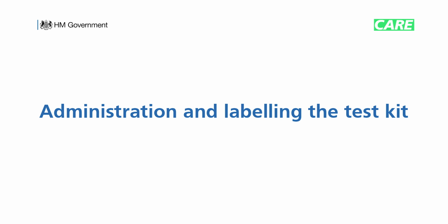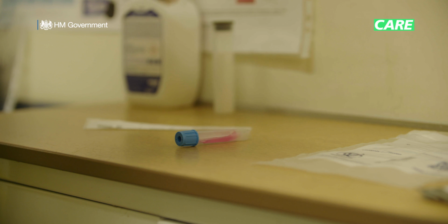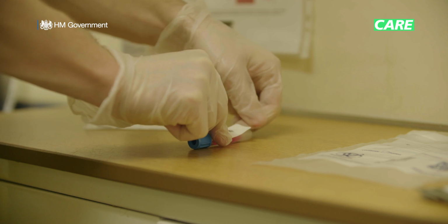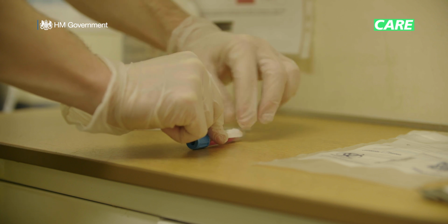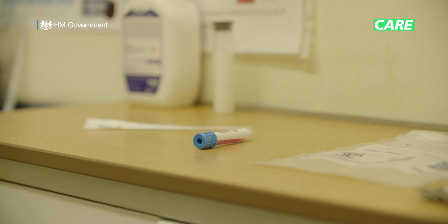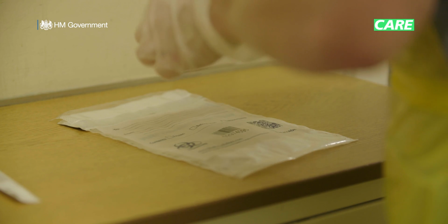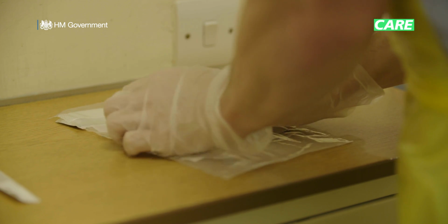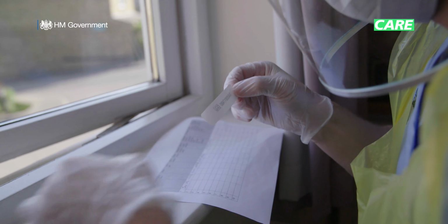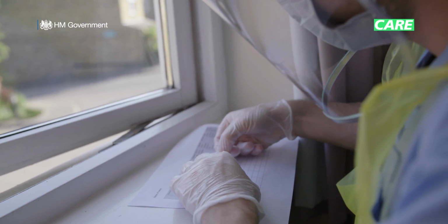With your kit unpacked onto the clean surface, you need to apply the barcodes provided with the kit. The first barcode needs to be placed onto the plastic vial. If it already has a label, just place your barcode label over it. The second barcode label needs to be firmly stuck on the patho-seal bag. Lastly, place the third barcode label on the test record or in the resident's care plan.